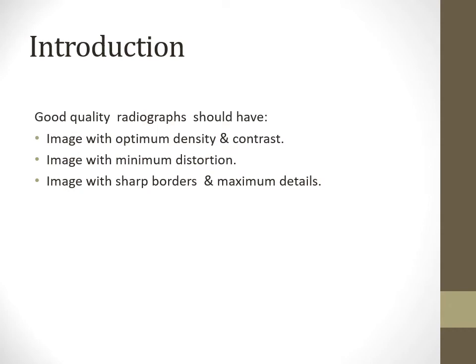Coming to the introduction, what are faulty radiographs, or when do you call a radiograph faulty? Good quality radiographs should have an image with optimum density and contrast, minimum distortion, sharp borders and maximum details. That is, the density should be good, the contrast should be good, there should not be any distortion of the image. The image should be sharp with maximum details.